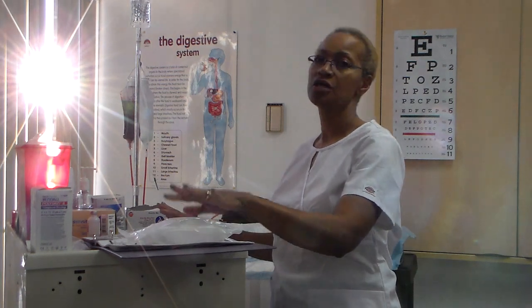Assess client's understanding of purpose of medication therapy. So while you're in the room, you're going to make sure that they understand why they're getting an IV, and if you're changing the medication, what the new medication is going to be. So of course, you're going to educate your client.